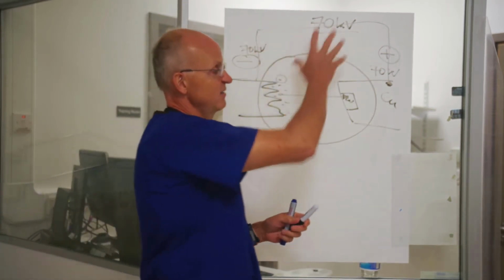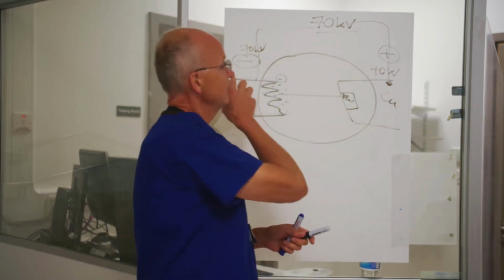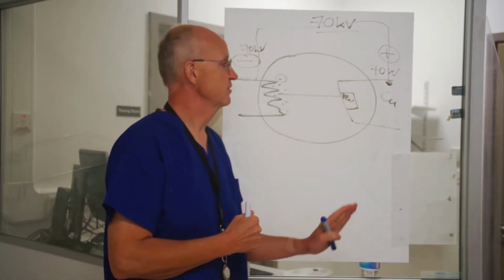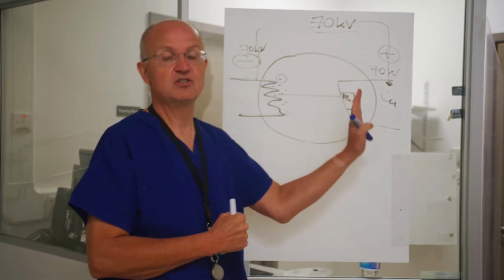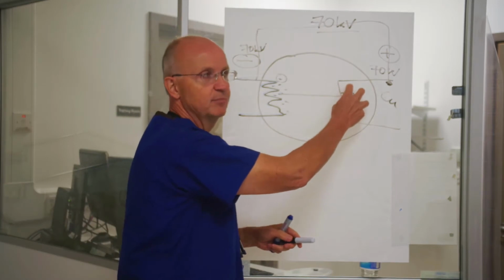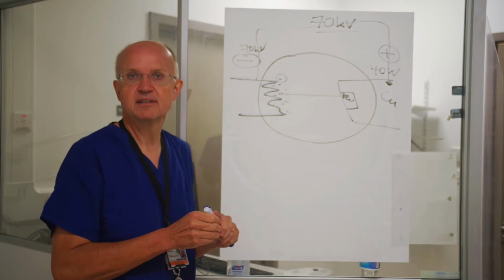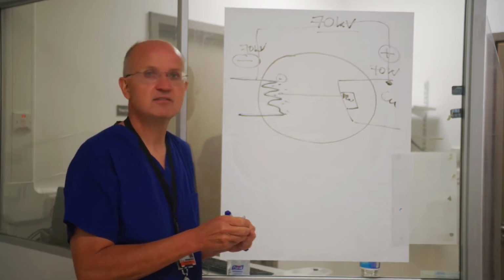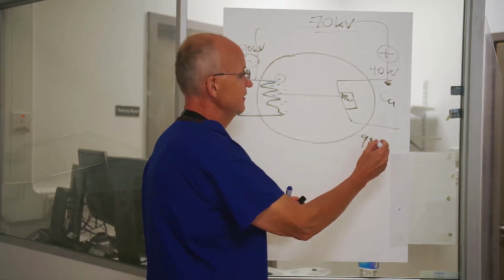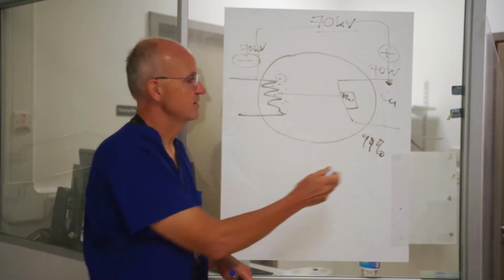So we have given energy here because we've got a potential difference between the two. These little electrons accelerate across, gaining kinetic energy as they do, and they're suddenly decelerated, and that energy's got to go somewhere. So as Sarah said, you've got a number of interactions that happen within this lump of metal here. And what's the most significant transfer of energy that we get? Heat. Heat, yeah. So 99% of the energy that we gain going across that X-ray tube is developed as heat.